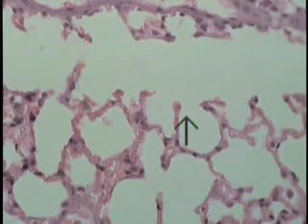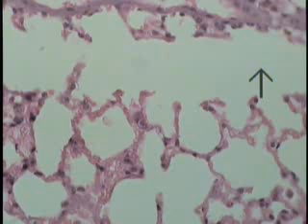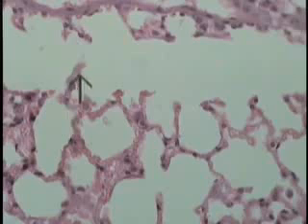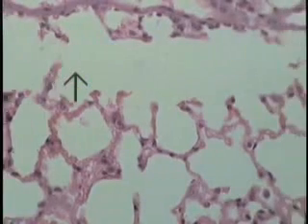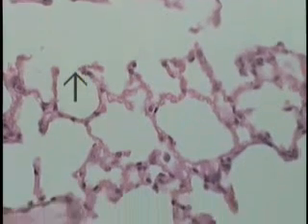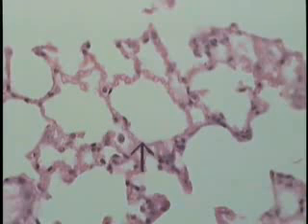Increased magnification of the alveolar duct in the mouse lung to demonstrate the alveolar duct, showing you indeed that it is made up of successive alveoli. And note the very thin nature of the wall of the alveoli. Here we see one that is cut in cross section.